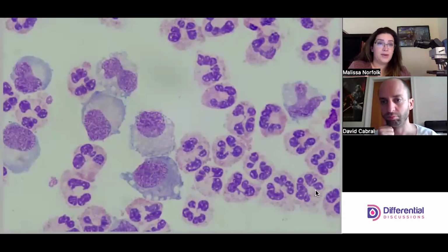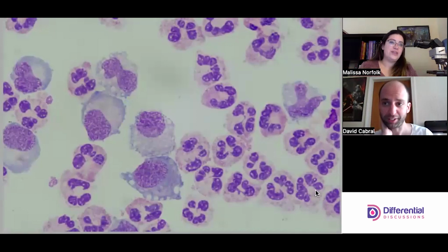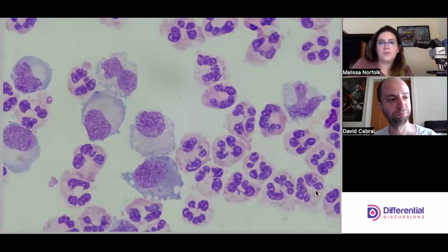If there are a lot of mesos or lining cells there, you're thinking, well, maybe it's mesothelioma, or something wrong with those mesos. That would be something completely different for us to agonize over, and maybe we say, hey, pathologist. But I'm not going to waste a pathologist's time with this, or another tech's time, to be honest. Agreed.